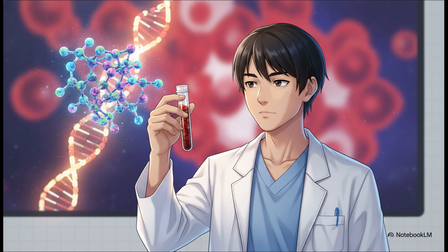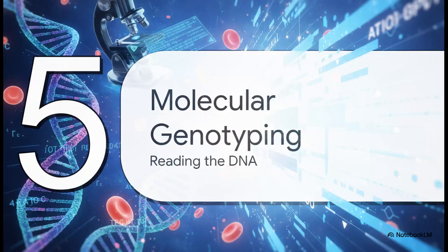So, for highly complex cases, like sickle cell disease patients who need constant chronic transfusions, or when we're trying to differentiate between really subtle variations in the Rh factor, relying on visual clumping just hits a hard biological ceiling. Plus, sometimes commercial antisera don't even exist for the incredibly rare blood antigens out there. We desperately need a deeper level of analysis. And that is exactly where the molecular revolution comes in.